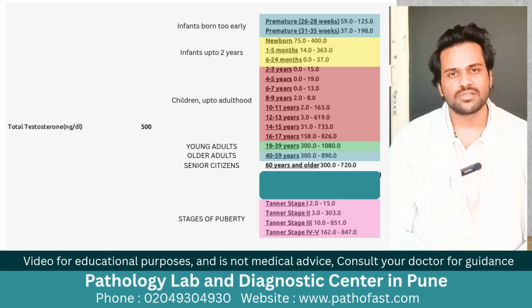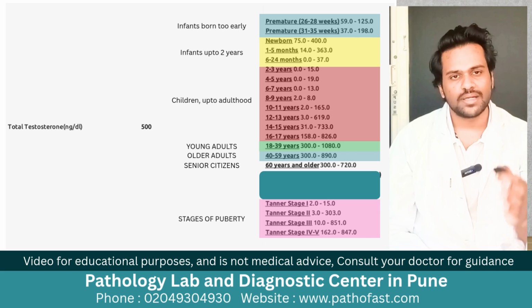So these are what the normal ranges look like. The way you need to look at this is just take a look at your age and look at the row that represents your age and only compare your value to that.